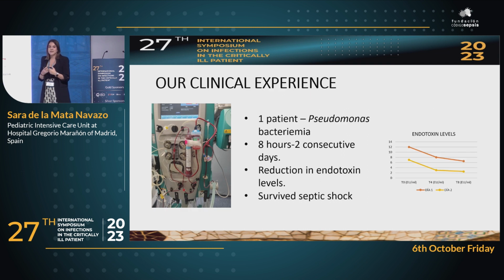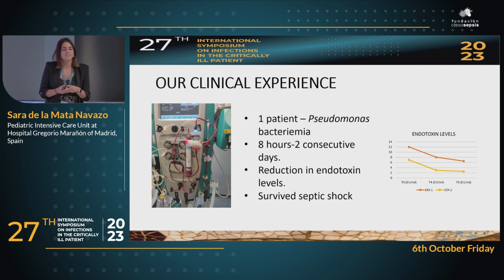And then I'm going to speak about our small clinical experience with polymyxin cartridges. A few months ago, we used a polymyxin cartridge, the small one, in a 5-year-old patient that suffered Pseudomonas bacteremia. We performed 2 consecutive sessions that lasted 8 hours on two consecutive days.